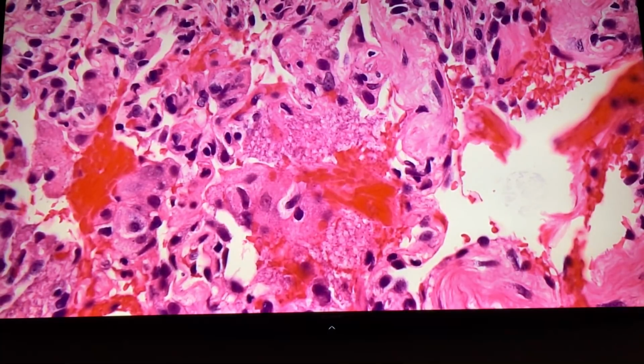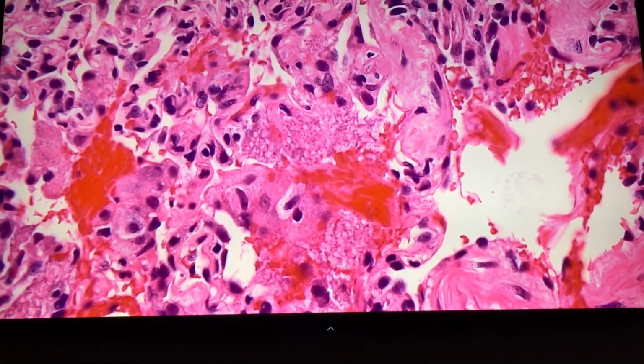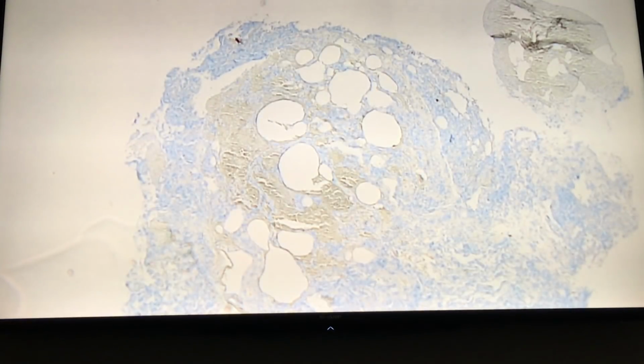The alveolar septa are minimally involved, very slightly thick, a bit inflamed at top right. But the action is in the air spaces, and you have this frothy, bubbly material, and in there are the organisms. So I want you, Aaron, to just show now the GMS, and we'll come back to this again. So keep that slide with you. I have actually diagnosed PCP in practice just on the H&E. I sign it out and do the GMS later because you want treatment to start quickly. These patients are hypoxemic, can be very sick. But the diagnosis can be made.